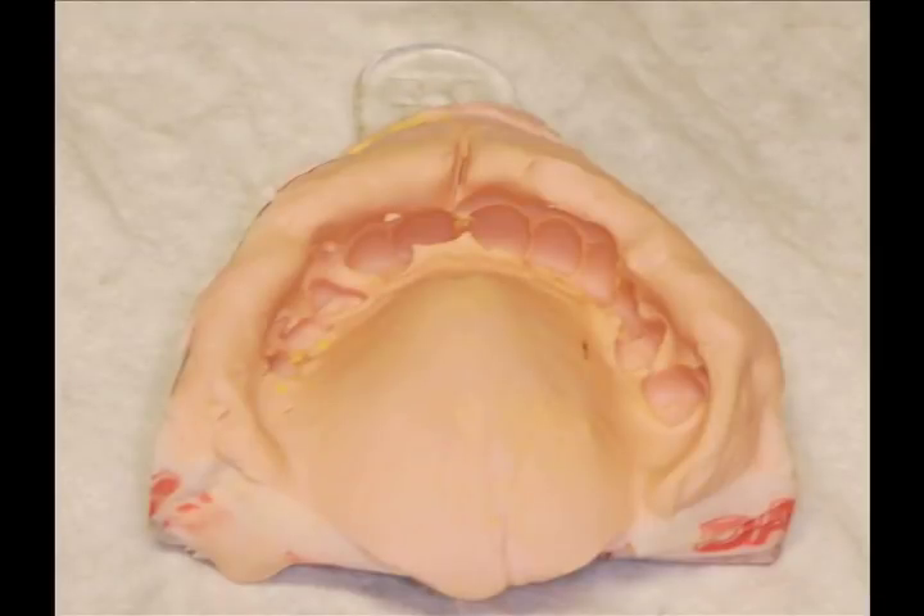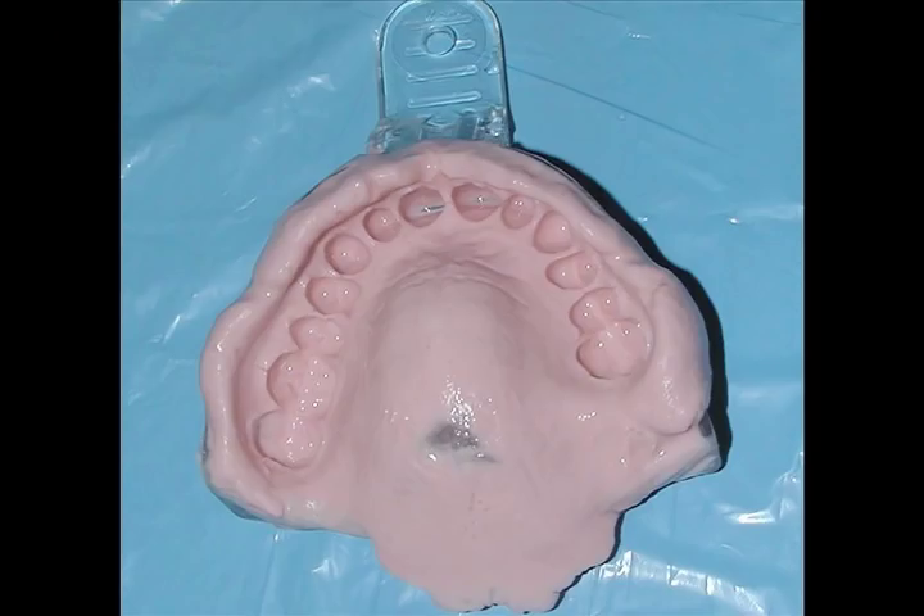This next impression is a separate impression taken with the fifth hand retractor in place. As you can see, the entire fold is captured in the impression.